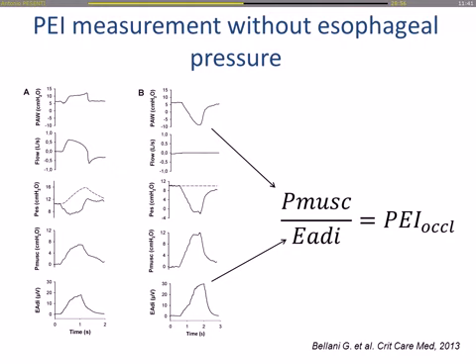the correspondence between microvolts and centimeters of water without the esophagus, because I have calibrated it with the inspiratory occlusion, and because by definition, during inspiratory occlusion, the change in pressure in the airway equals the change of pressure in the pleural pressure.